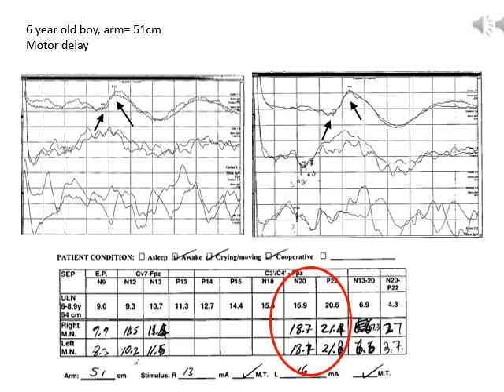What we need to use at that point are interpeak latencies. After looking at the absolute latencies, we then turn to look at the interpeak latencies. They are still useful for us because regardless of whether there's an earlier delay, the interpeak latency still reflects the conduction between just the 2 points. And so when we look at the interpeak latencies, we note that there's a prolongation of the interpeak latency between the N13 and the N20 on the right median nerve. This suggests that there's a delay in the conduction between the generator of the N13, which is the cervical spine, and the generator of the N20, which is the cortex. And so this interpeak latency delay suggests that there's a dysfunction between cervical spine and cortex.